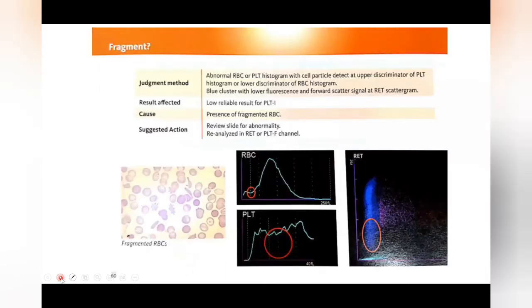Let's look at another case. Who's going to tell me what is this? Quick guess, what is this? I think my time is also over. So quickly, can you tell me what is this? Very good, iPhone. Perfect. So these are fragmented red cells. Good, Dr. Shakir. Very good, Dr. Nazia. Perfect. So these are fragmented red cells, which we have already seen. Right. So fragmented red cells. Perfect. Look at this smear and you'll be able to find these fragmented cells.